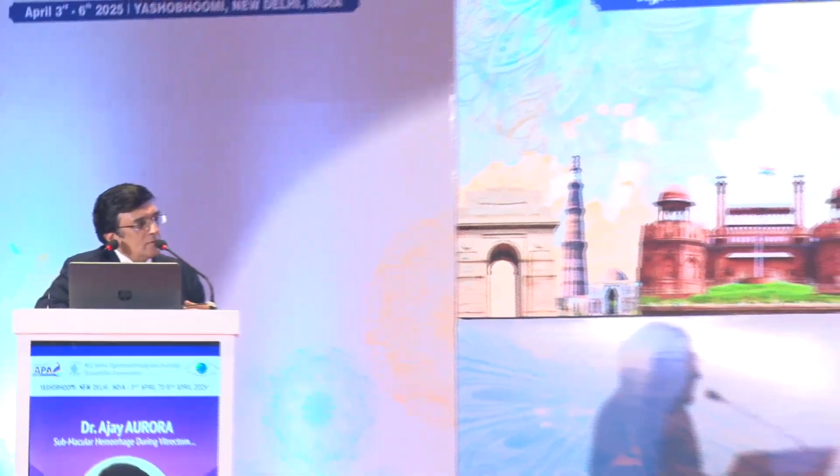Great talk, Ajay. So my question is, when will you not feel bothered to stop the bleeding? For example, in your case, the bleeding is coming from the inferior part, after the laser. After that, it's seeping toward the macula. But you know that after this surgery, the patient has a prone position to displace the blood from the macula. So when will you look at that kind of case and say, well, I'm not worried about this, and I have the patient have a tamponade without any further intervention?